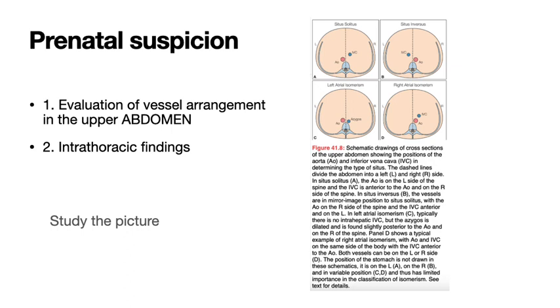And if you have the aorta on the incorrect side, which is the right, but your IVC is in its normal place, think, oh, maybe we have an absent left and we're doubling up on the right-sided structure. So absent left, yep, the aorta is going to be over on the right side.